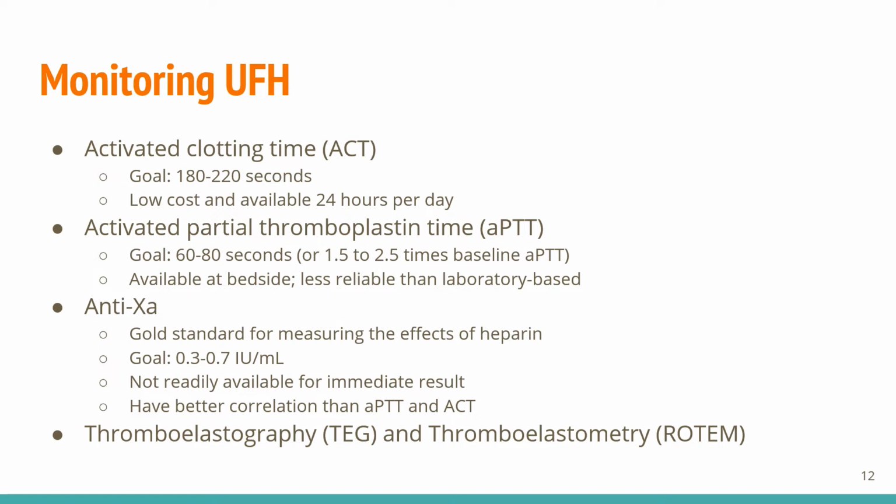However, there are many factors that can affect ACT, including platelet count and function, the level of patient fibrinogen and coagulation factor, the renal function, and the hemodilution status.